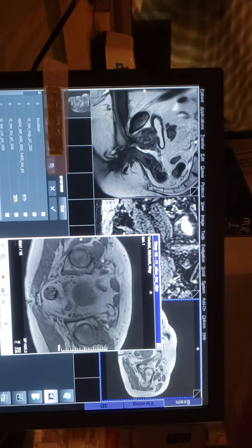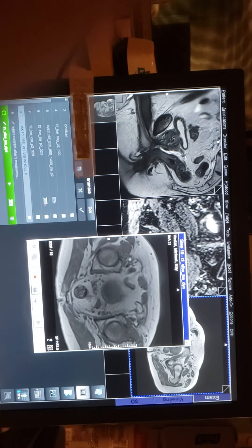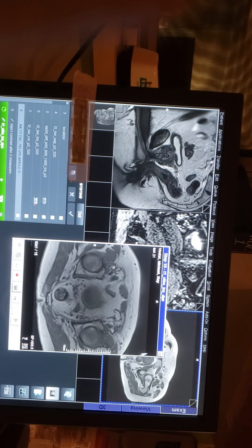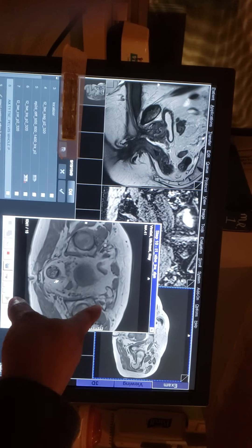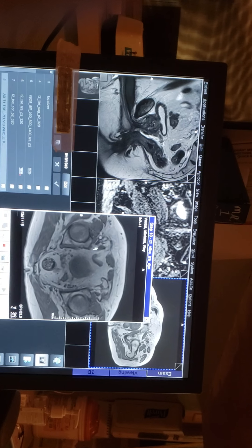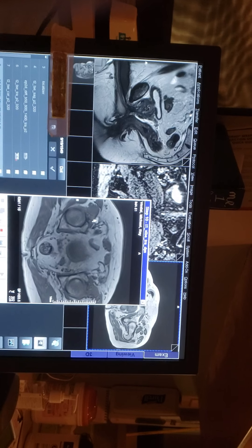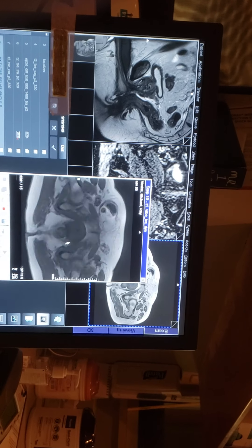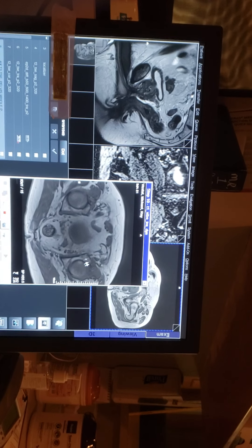We want one picture without the contrast, and then the contrast going in. Now we're going to see the dynamic coming here. I'm looking at my vessels — I'm waiting for them to be bright, so the contrast starts coming in. As you can see, that's pretty much all to it.